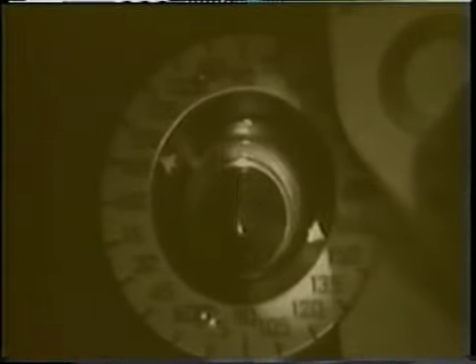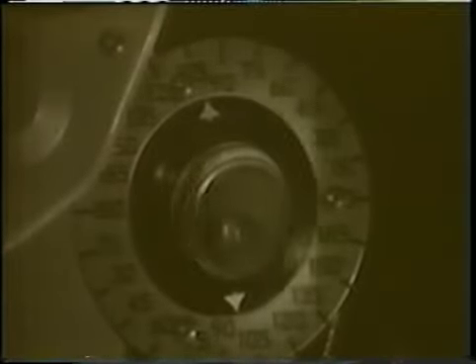The first thing to think of here is a high refractive error, for the reflex in high refractive errors always appears dim at first. Crank in large amounts of plus or minus sphere to try to improve the reflex, like so, and then continue to neutralize the reflex. If the dim reflex is not improved with high plus or high minus sphere, suspect a cataract or other cause of cloudy media. Try to move in closer to get a brighter reflex, or use one of the new retinoscopes with a bright halogen bulb. Those are most of the problems you'll encounter with the retinoscopic reflex.